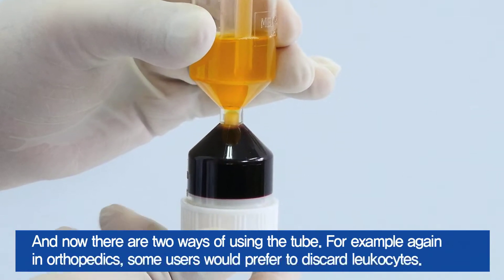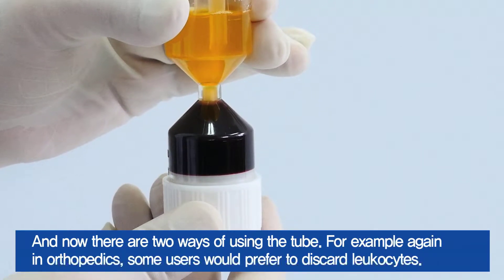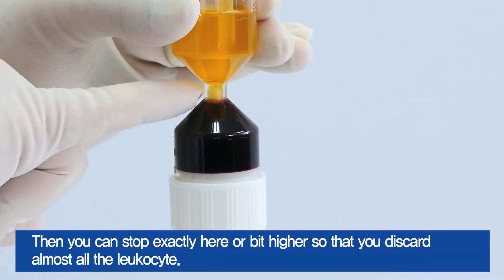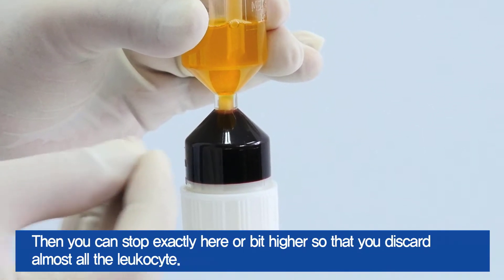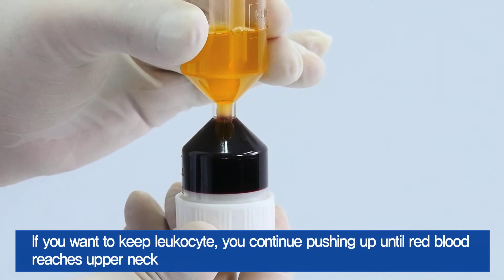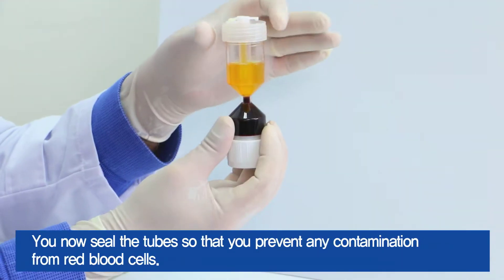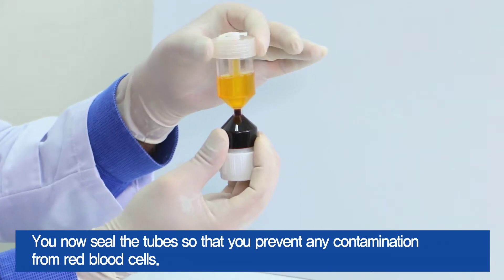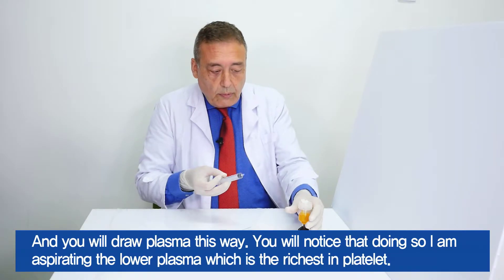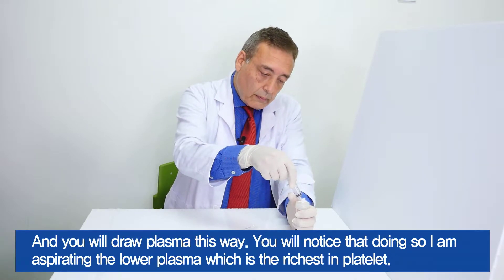And now there are two ways to use the tube. For example, again in orthopedics, if some users would prefer to discard the leukocytes, then you can stop exactly here or a bit higher so that you discard almost all the leukocytes. If you want to keep the leukocytes, you continue pushing up until the red blood reaches the upper net limit. You now seal the tubes to prevent any contamination from red blood cells.